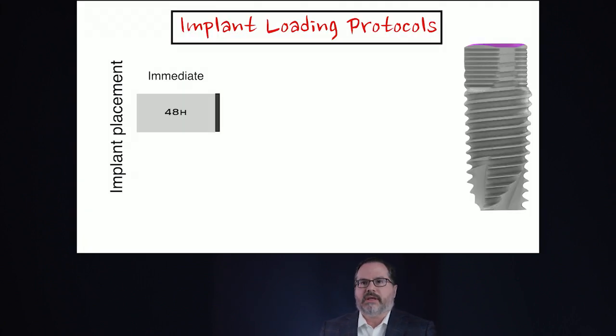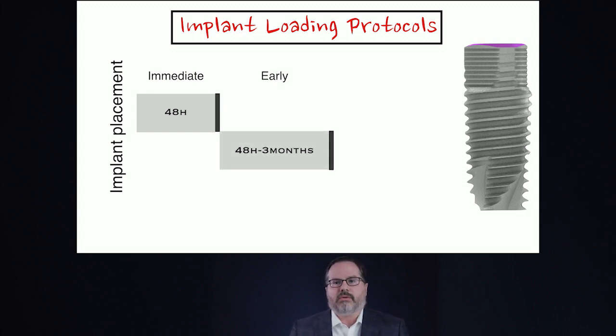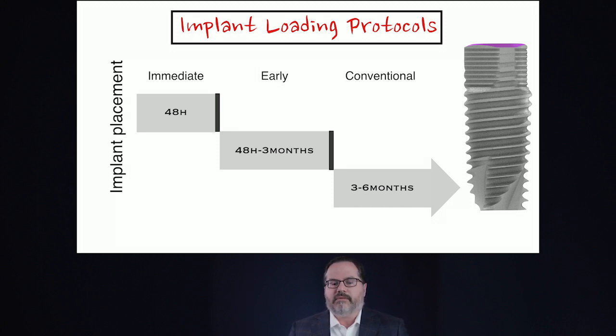So let's define some of the loading protocols that are available to us when we're talking about implants. Anything involving immediate loading, placement and loading, needs to be done within about a 48-hour period. An early loading protocol will refer to 48 hours up to 3 months. A conventional loading protocol will be anywhere from 3 to 6 months of healing time. And delayed will be anything plus 6 months.